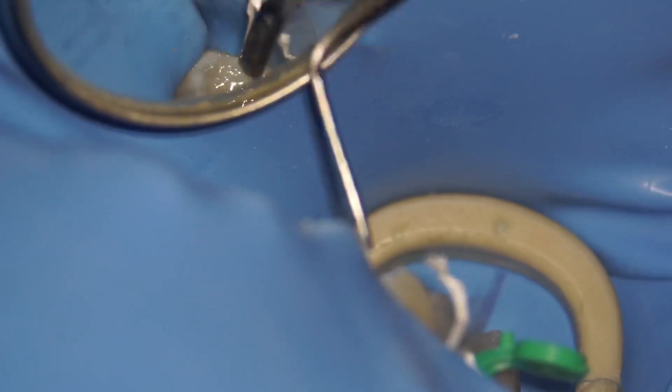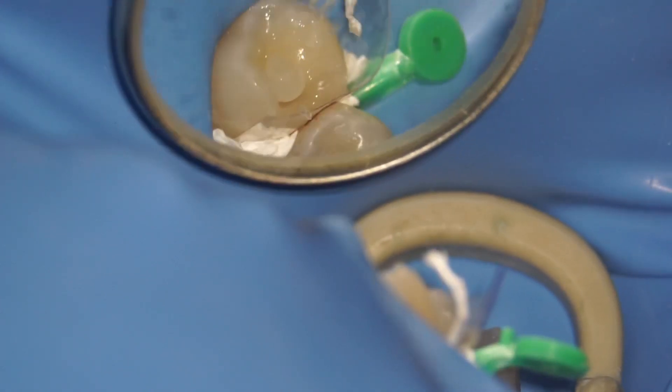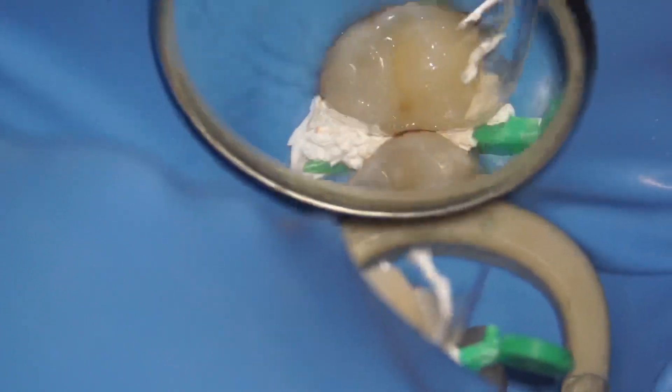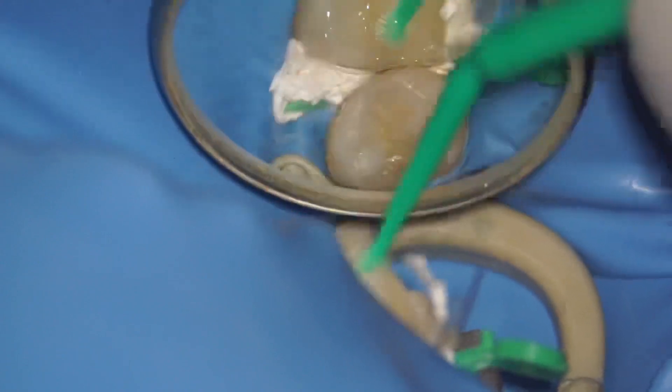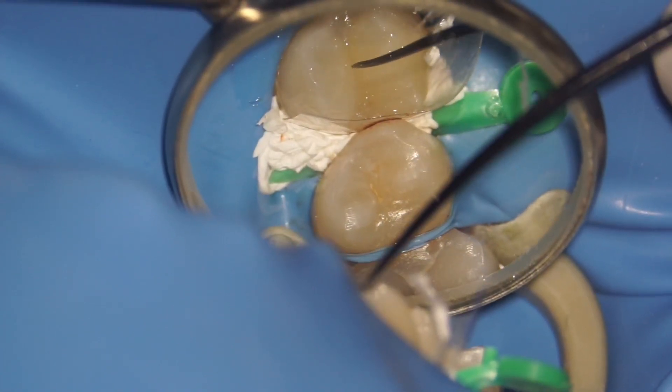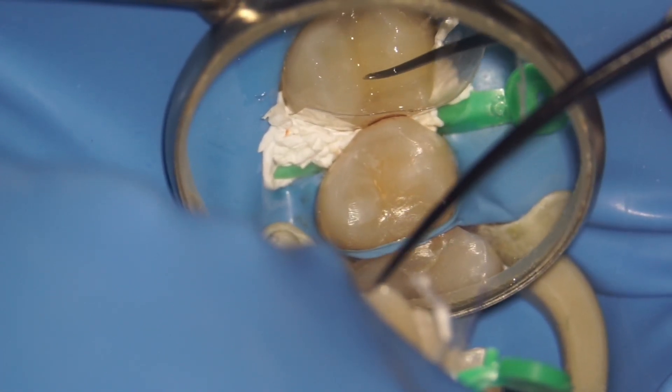Same way for the palatal cusp — just take your time, pack it in nicely, and use a brush with stick resin. You can use a micro brush, a silicone brush, or anything you find. Always use a sharp instrument to emphasize the grooves, like I'm doing right now.